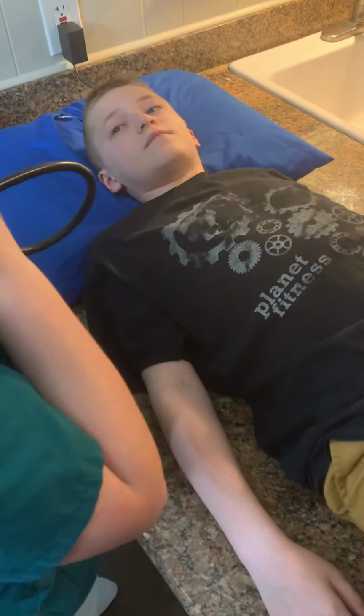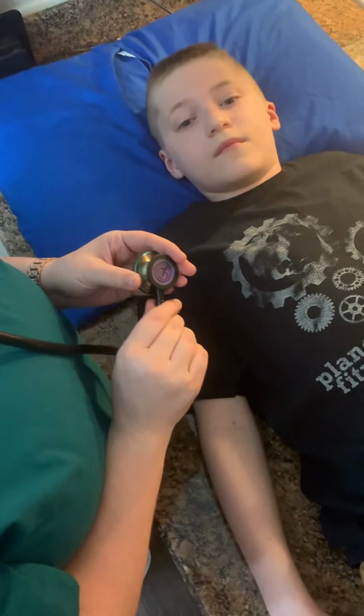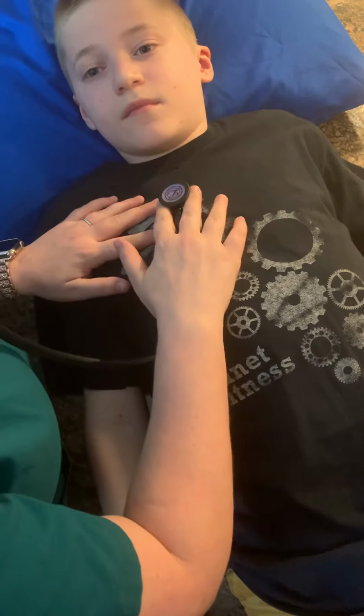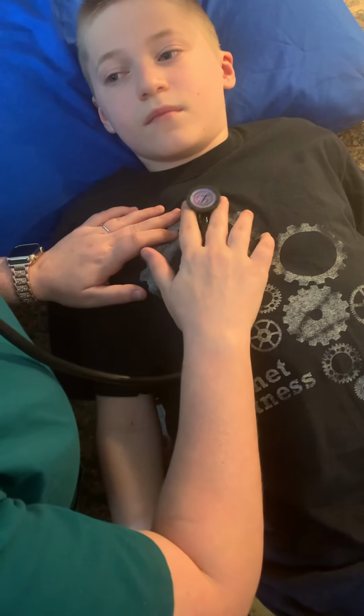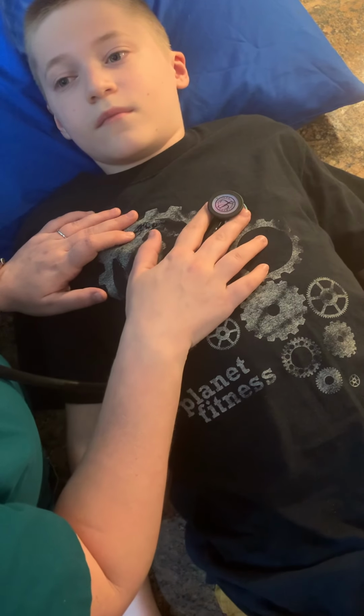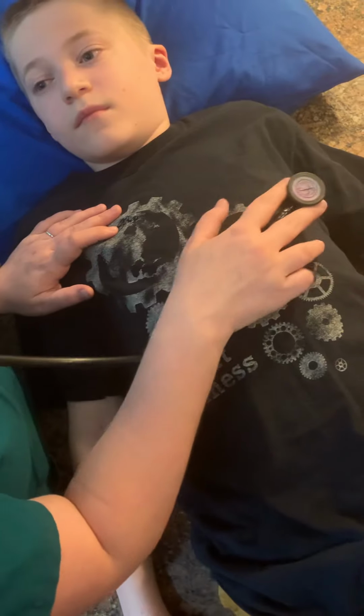So now what we're going to do is we're going to listen to all of those spaces again while you're lying down with both sides of the stethoscope, just like we did before, okay? With my diaphragm, I'm going to listen to your aortic, pulmonic, Erb's point, your tricuspid, and your mitral valve.